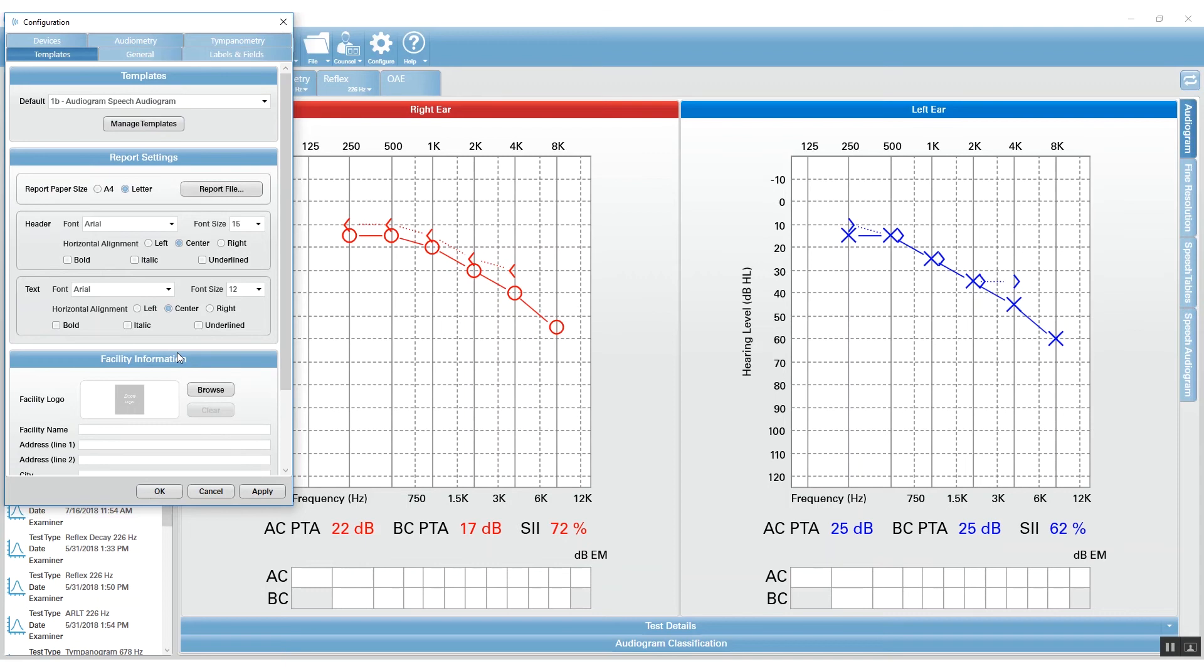...then you can move on to managing the templates and figuring out how you want your report template to look for your practice.